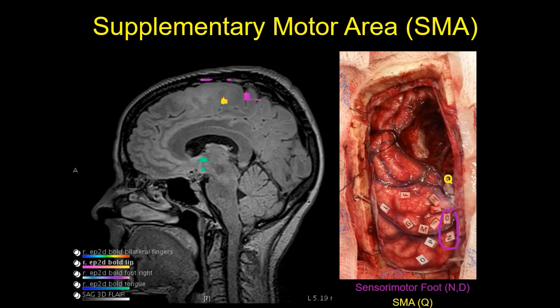On the right we see the intraoperative mapping details from direct electrical stimulation. As expected, foot motor and sensory activation was seen at sites D and N respectively.